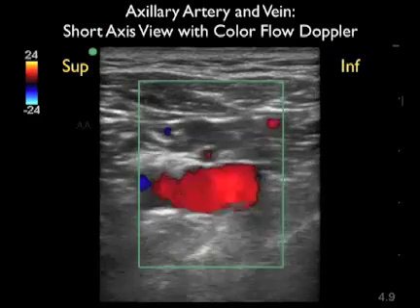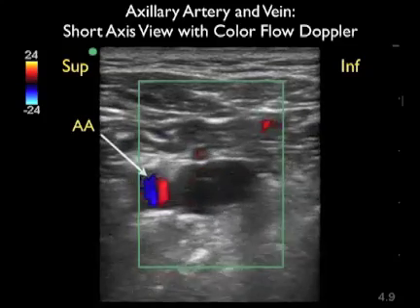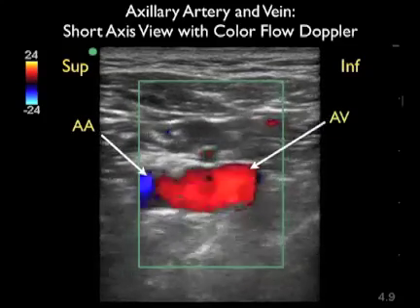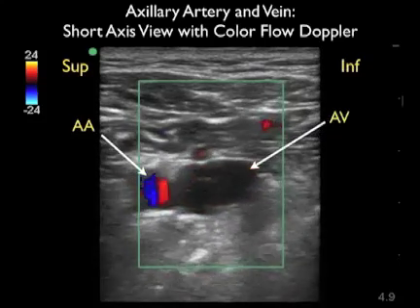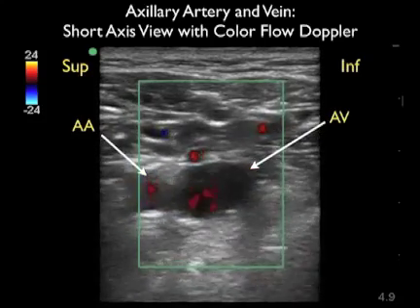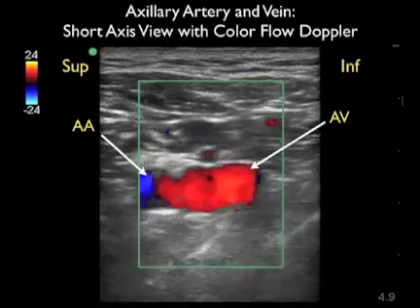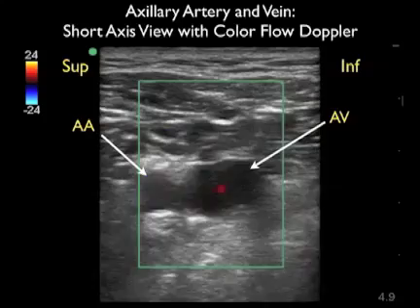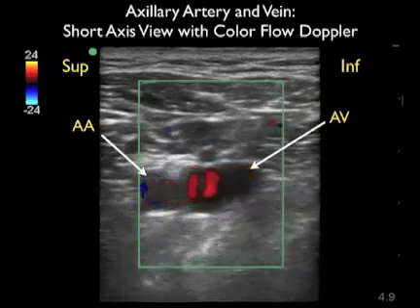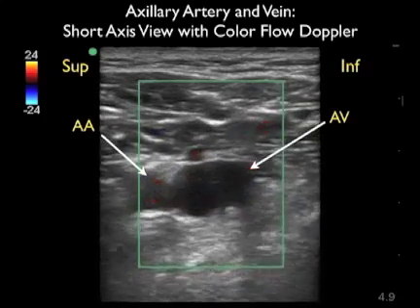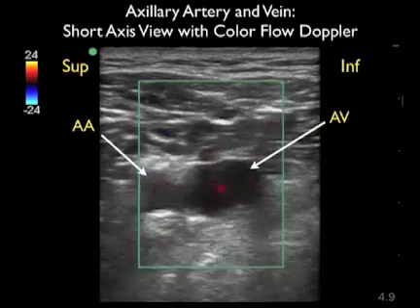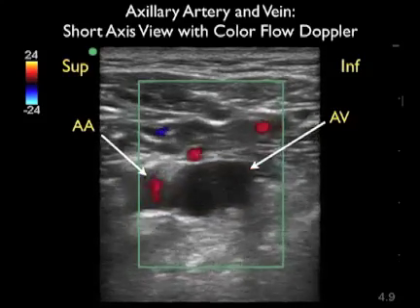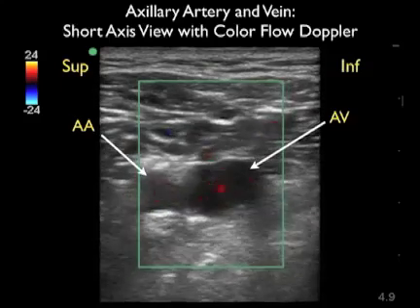In this ultrasound image, again taken from a short axis configuration, we'll use color flow Doppler to further differentiate the axillary artery from the axillary vein. Superior is to the left and inferior to the right. We can see the smaller axillary artery with pulsations indicating arterial flow, and within the axillary vein we see phasic respiratory flow corresponding to inhalation and exhalation — another way of differentiating artery from vein.